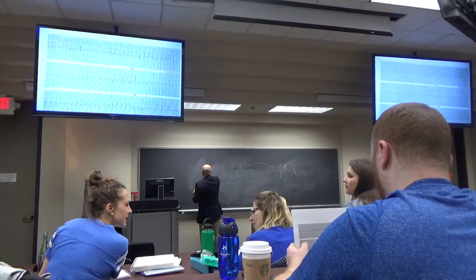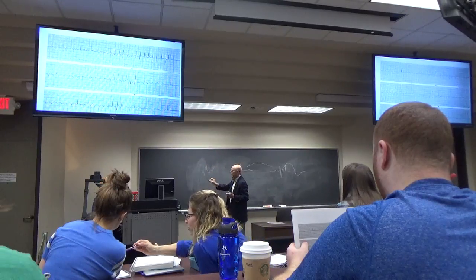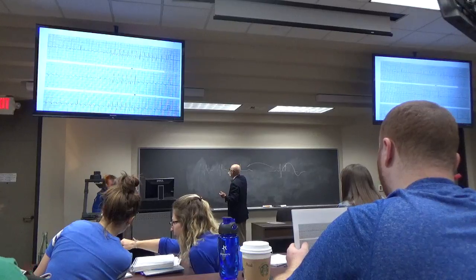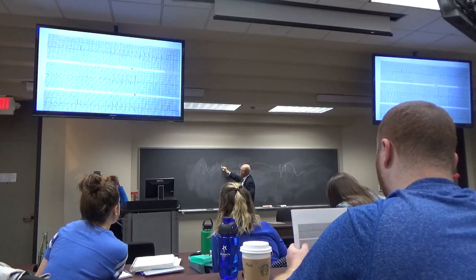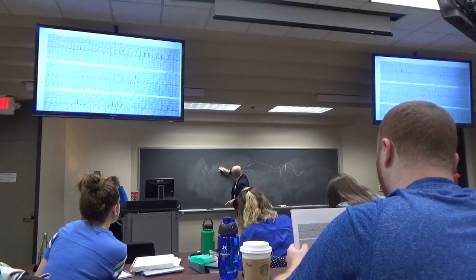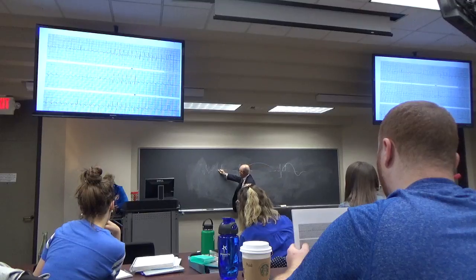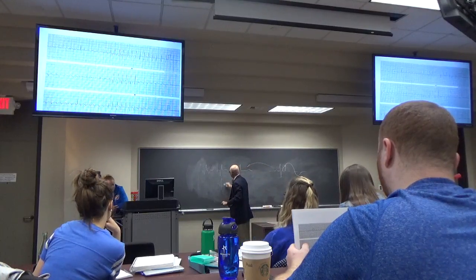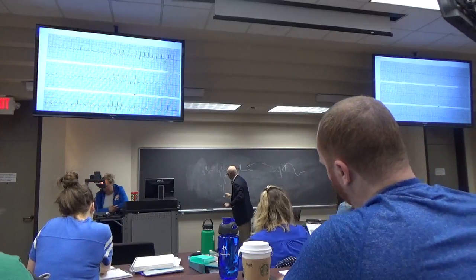This is what you see. If there wasn't an infarct, you'd see this. Right? If there was no infarct in the anterior wall, you'd see the rabbit ears. But what you're not seeing is that, because there's an infarct. So you're just seeing the R prime with the R gone because of the infarct.